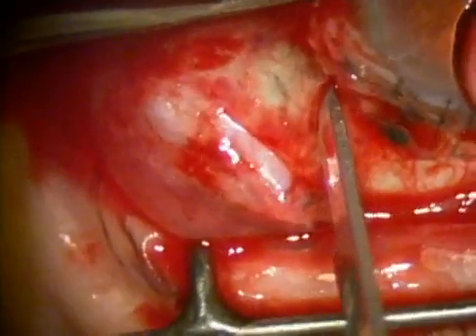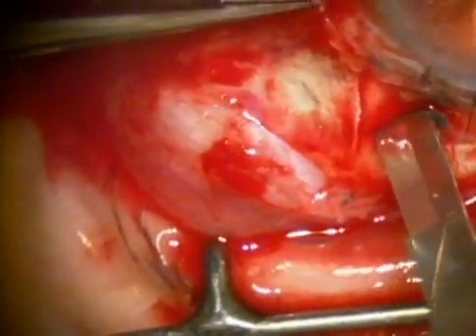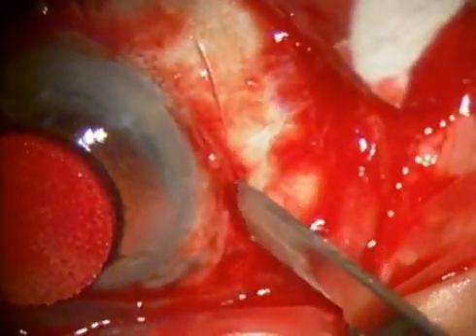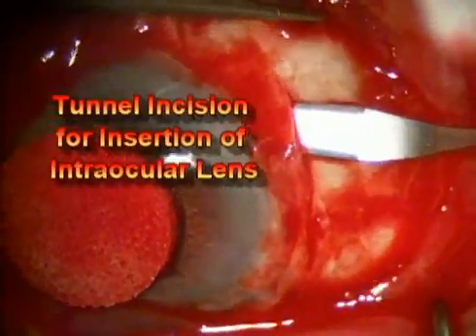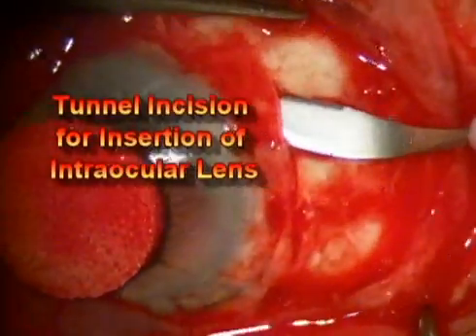This unfortunate patient had had previous cataract surgery, and she fell out of bed and hit her eye on a night table. Because of the trauma, she had her intraocular lens dislocated from the eye. Another surgeon did the vitrectomy to repair the ruptured globe, and at the time of the surgery felt it was necessary to remove much of the iris.